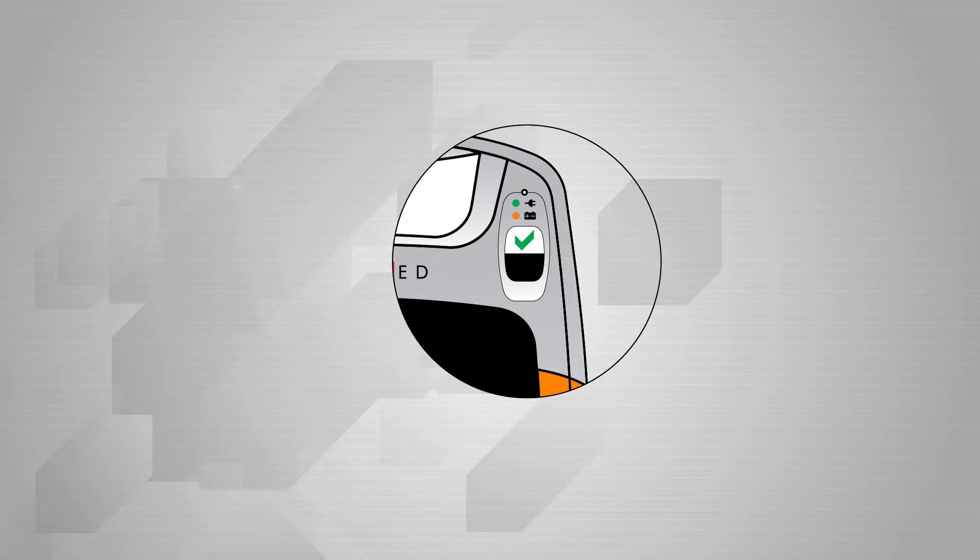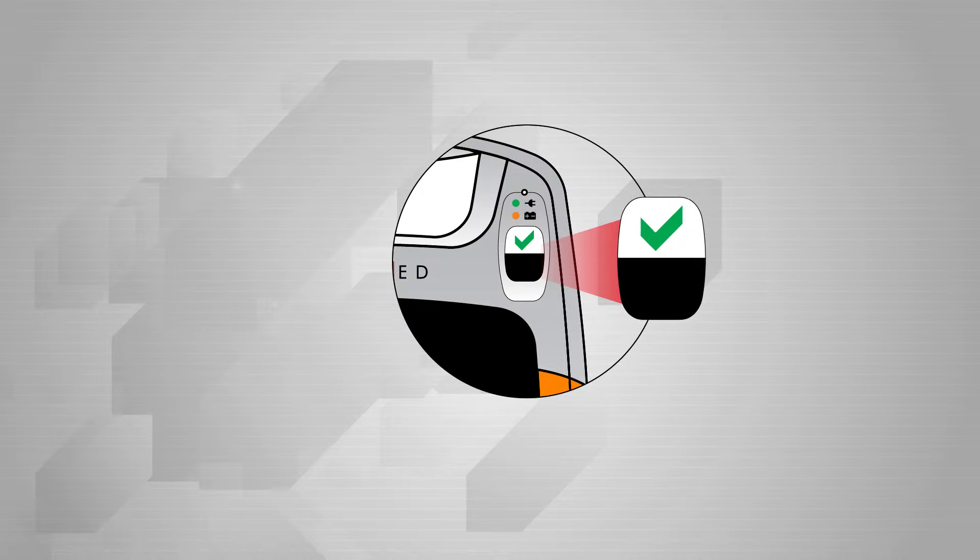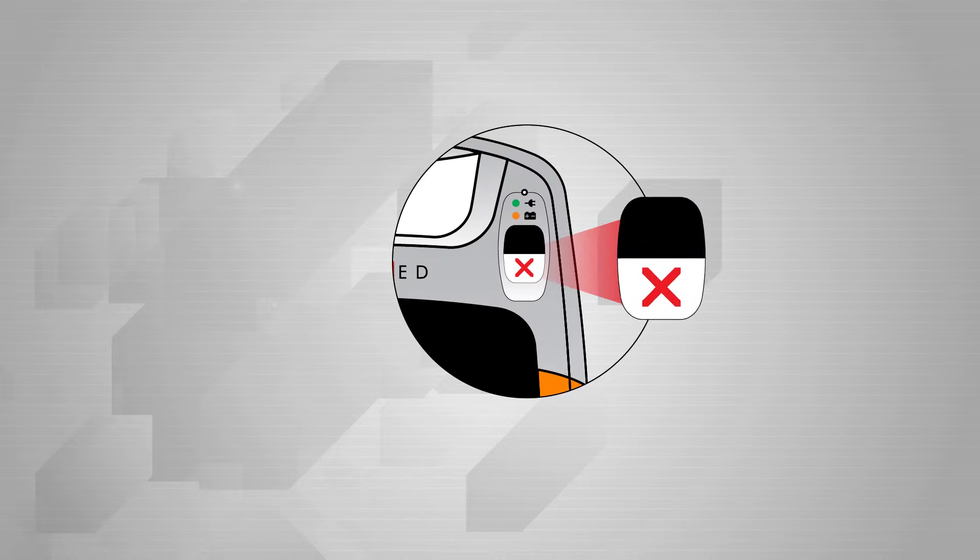Always check the operational status indicator. The green icon indicates that the eSys is ready for use. The red icon means that there is some sort of operational problem with the device or that it does not have enough of a charge to operate.